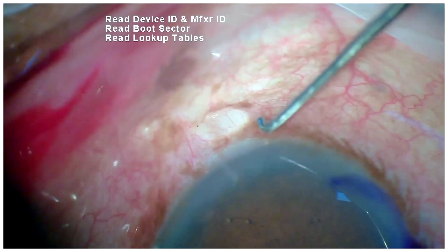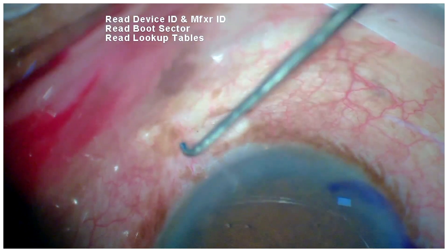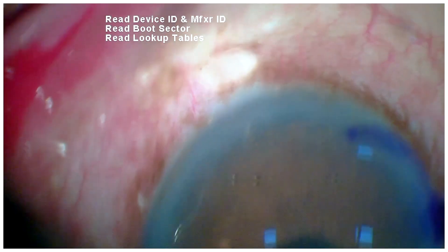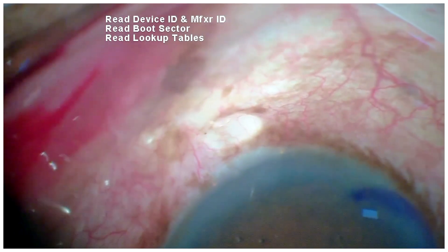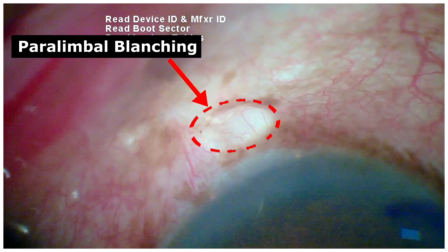Here, we can see the two iStents adjacent to each other via the limbus. And additionally, we can see an area of paralimbal blanching which depicts a successful outflow.